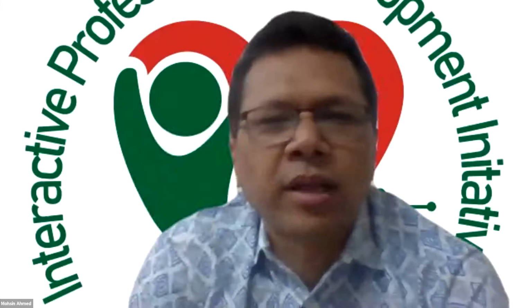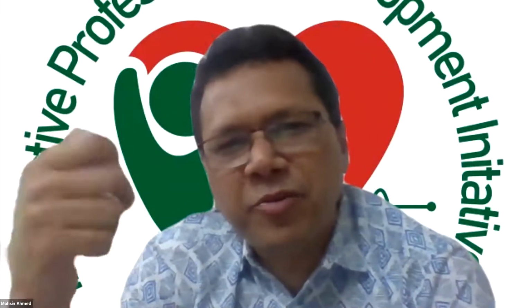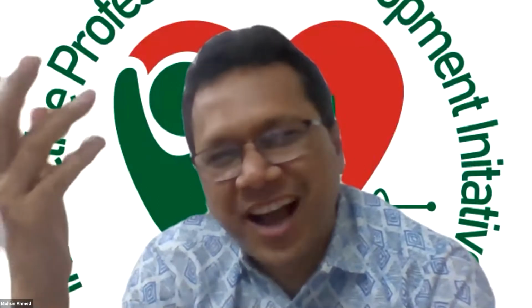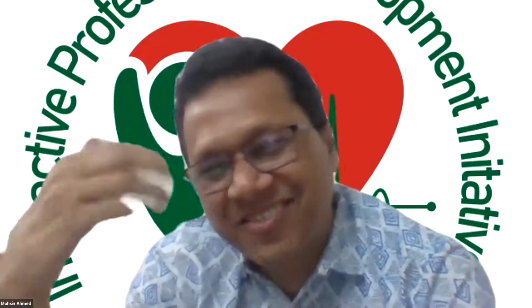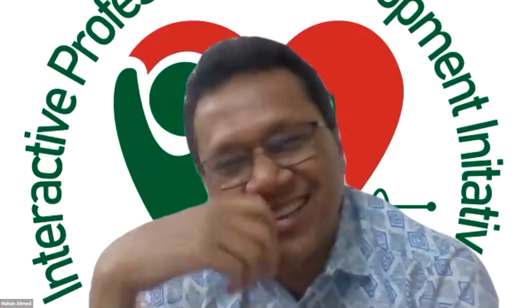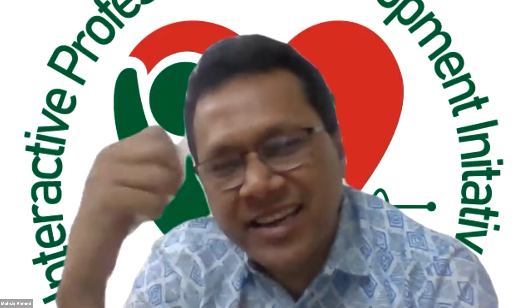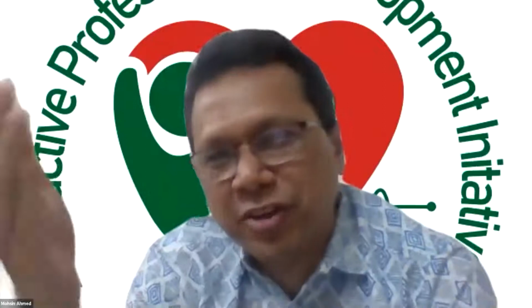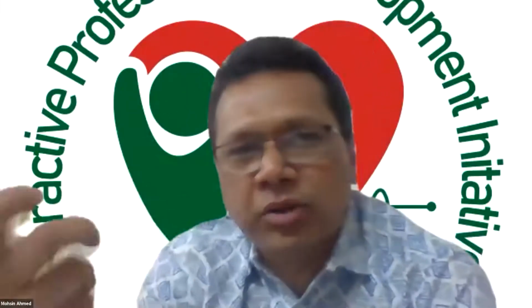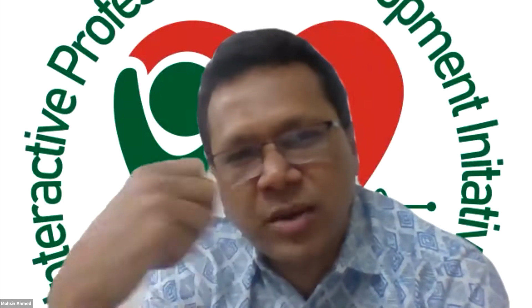Thank you. Another question: you're wiring. How bravely are you knuckling the wire in the antegrade way? How do the fellows feel about knuckling the wire the antegrade way? Mohsin, I love knuckling. For the fellows, you're the expert. How are they knuckling the wires into the subintimal space?